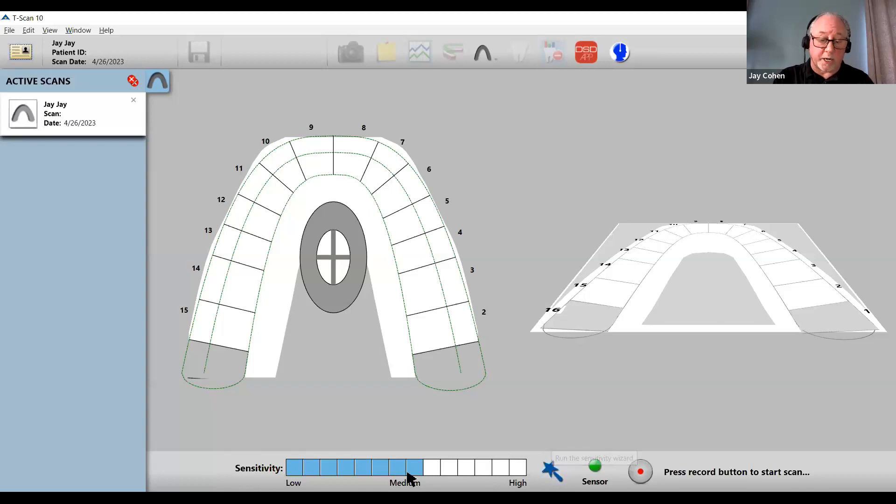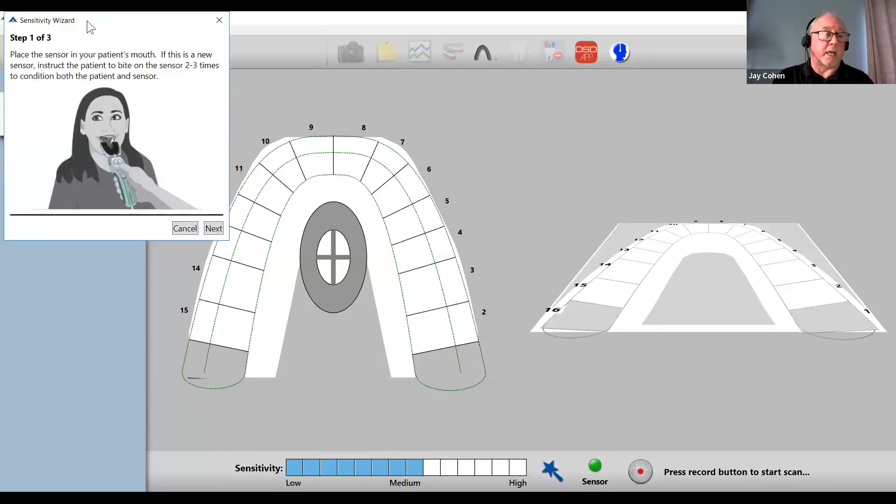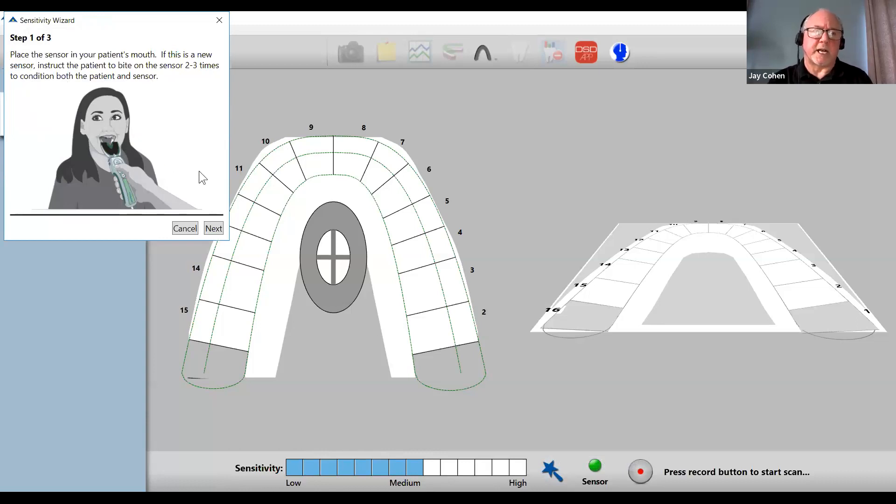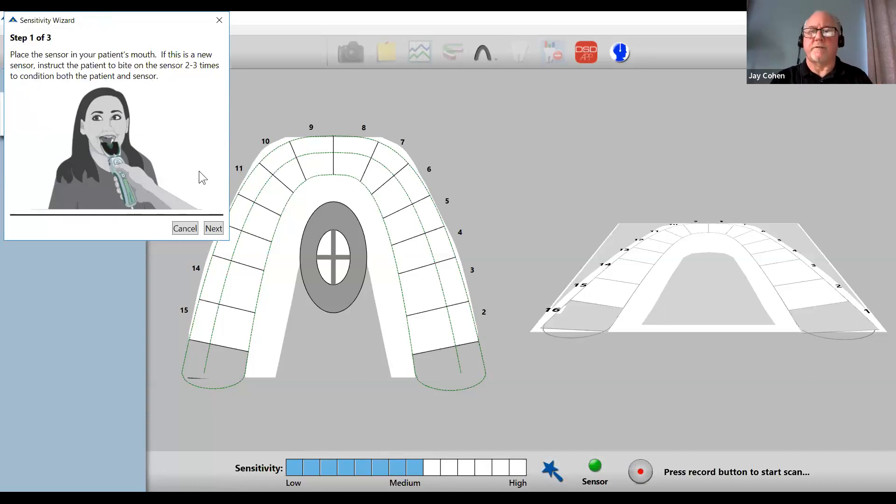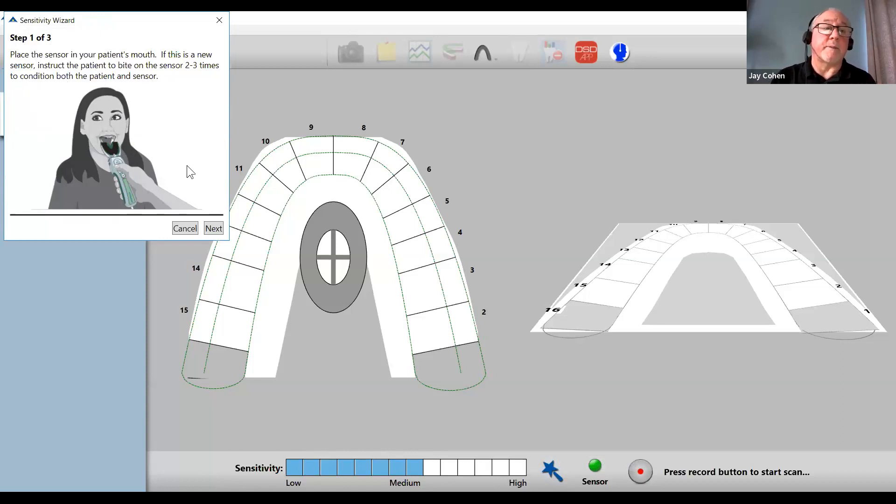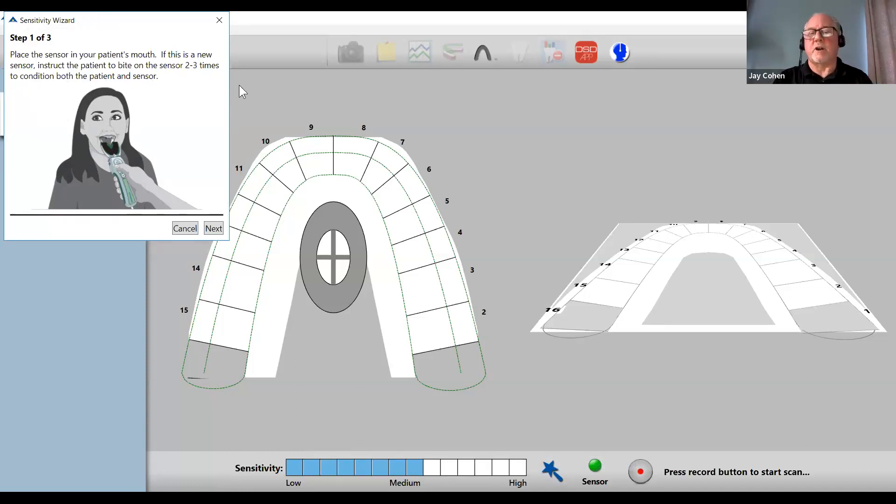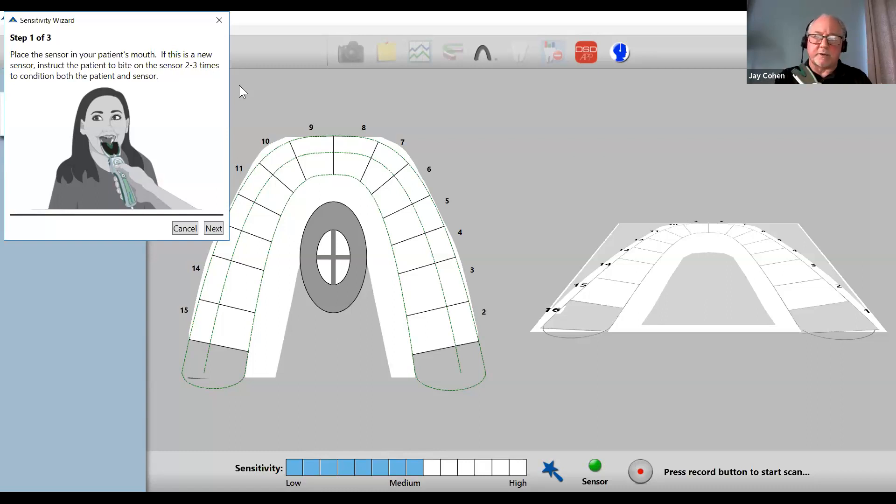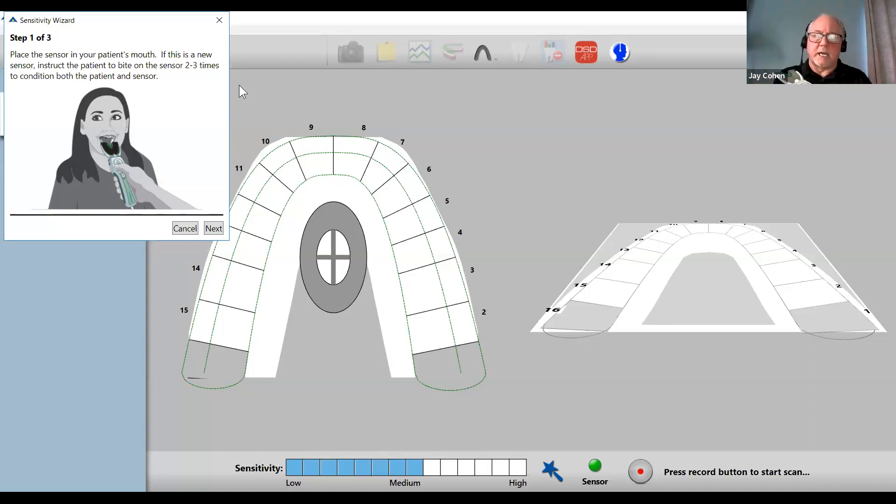There's a wand here on the right. If I click the wand, a wizard pops up on my upper left hand corner with instructions. This is step one of three. The truth is really only two steps. Step number one tells you to have the patient bite two to three times to condition the sensor and the patient.